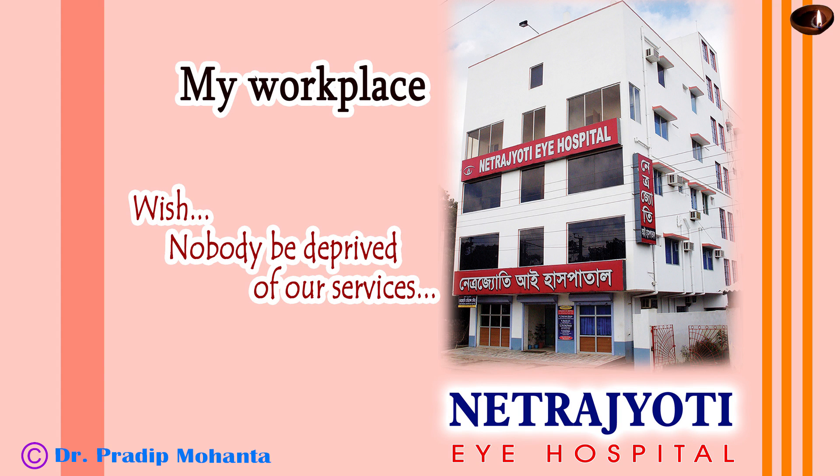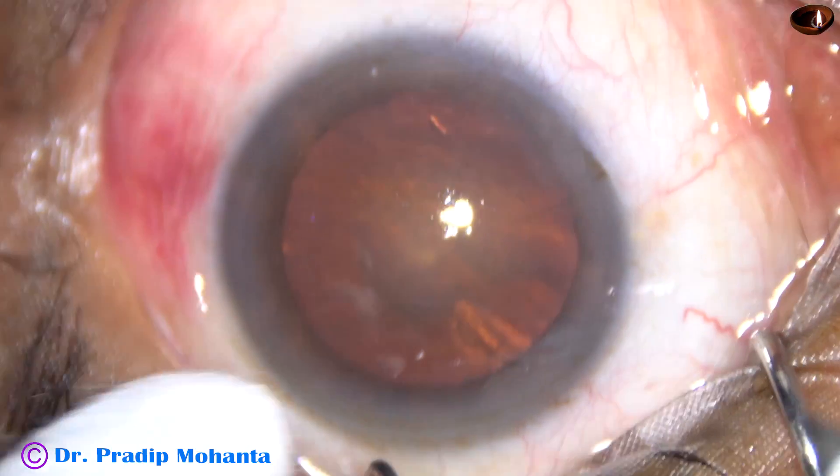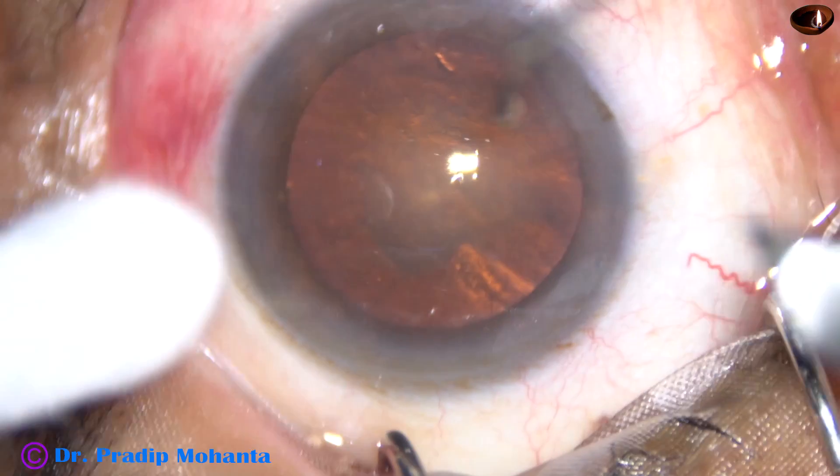Friends, welcome to my workplace at Ranaghat, West Bengal, India. This is phacoemulsification of a soft cataract. Let us observe the surgical steps.